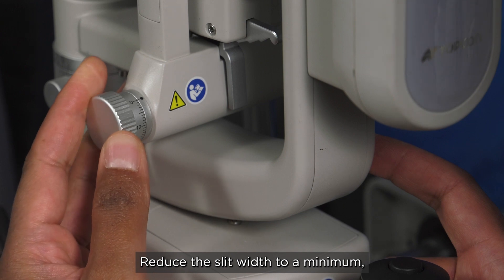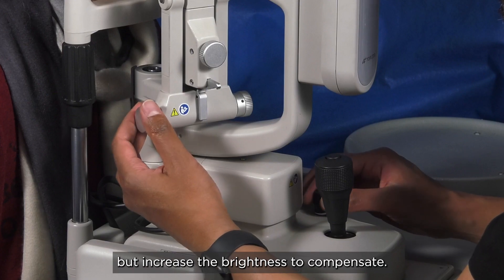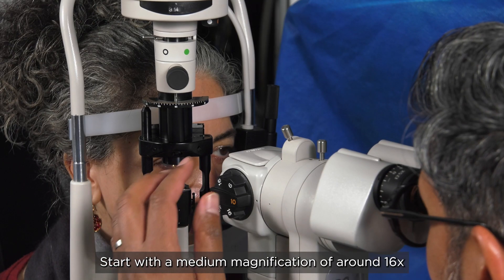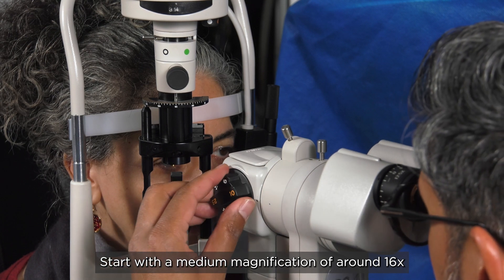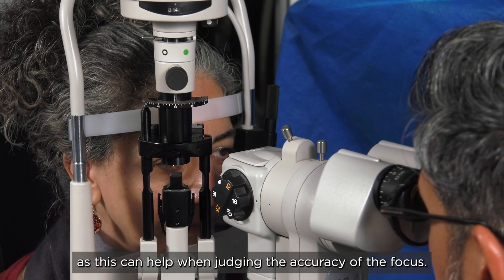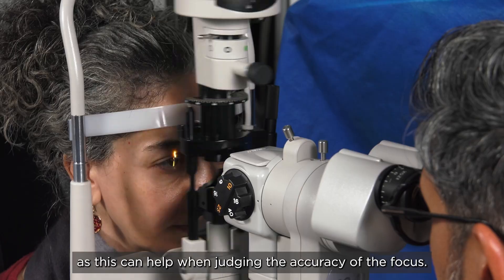Reduce the slit width to a minimum but increase the brightness to compensate. Start with a medium magnification of around 16 times, as this can help when judging the accuracy of the focus.